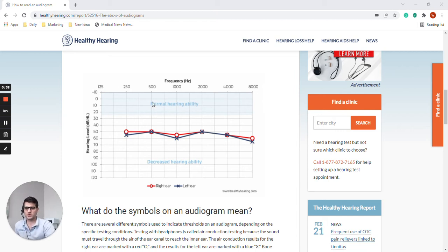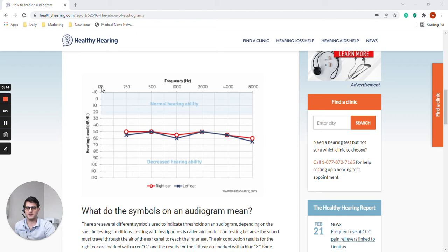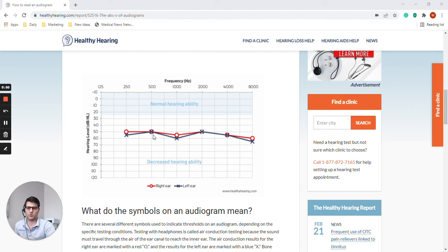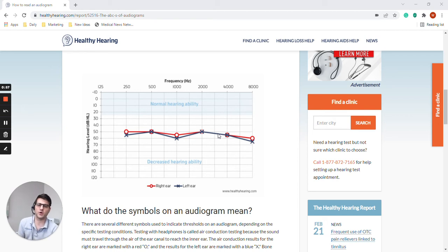Along the vertical axis we have loudness or intensity. This is how loud the sound was that the person was able to hear in this particular test. So these test results are test results from air conduction pure tone testing for audiometric thresholds.